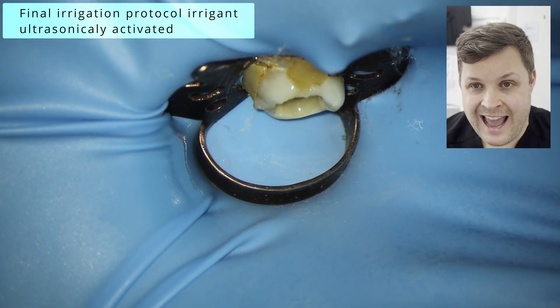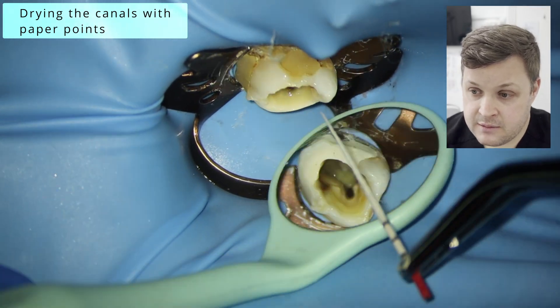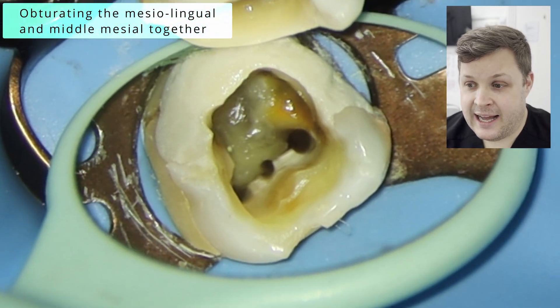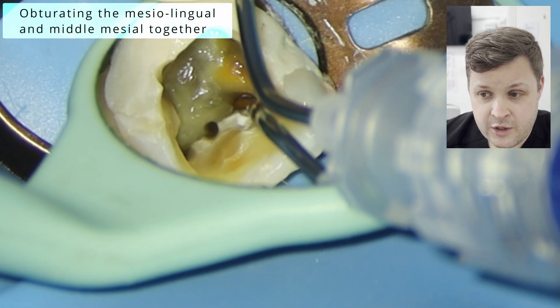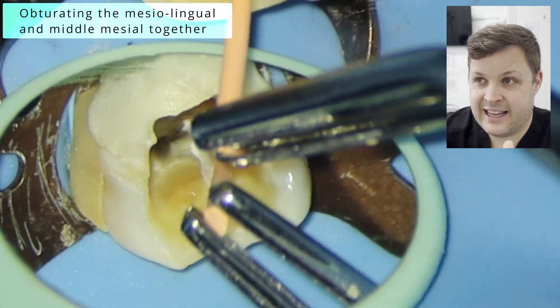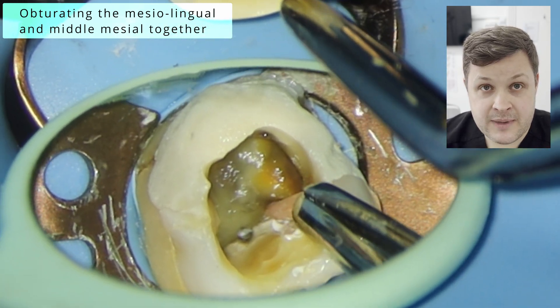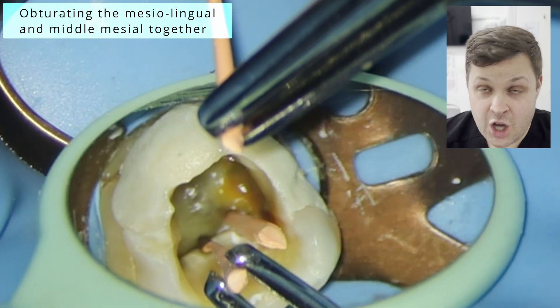Final irrigant protocol: ultrasonically activating sodium hypochlorite with the ultrasonic tip. I don't do a final EDTA irrigation because I use HEDP — a mild chelator mixed within the bleach and used throughout the canal treatment. Drying canals with paper points, then obturating with bioceramic one-fill and GP points. With joining canals, directly syringing bioceramic carries a risk of taper lock — an air lock where the GP bobs up and down — but the two joining canals act as a vent through the middle mesial.